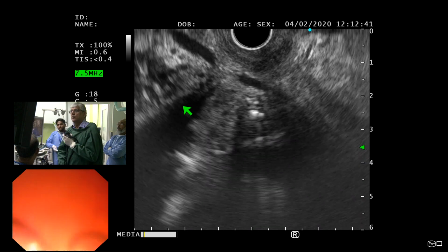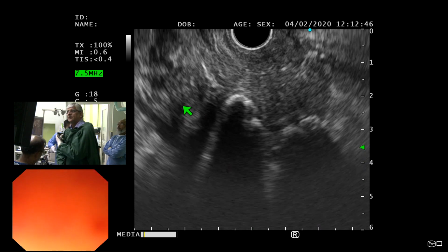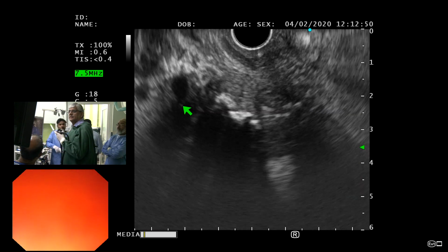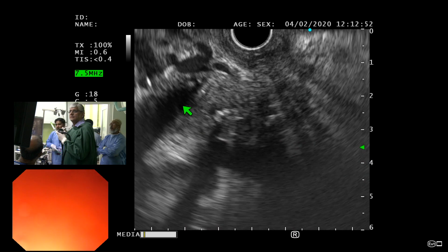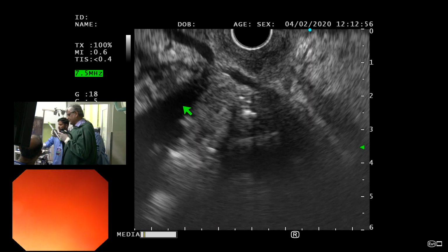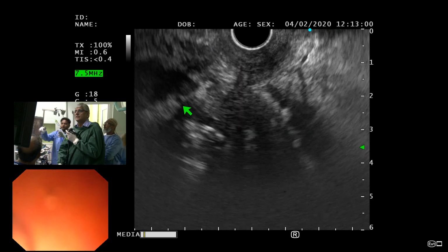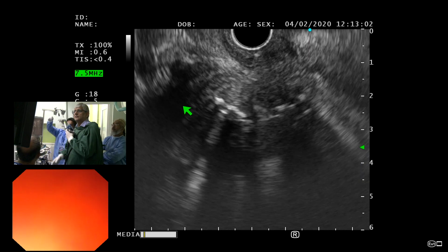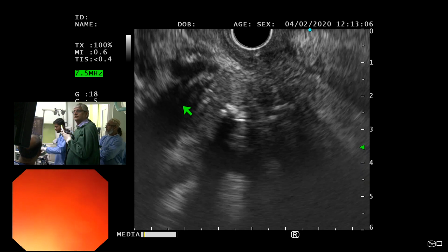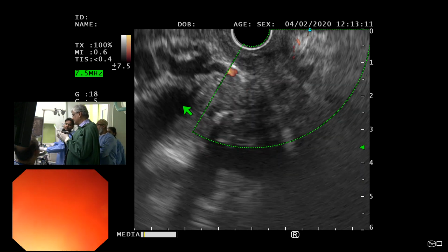I just want to go where the stent is. Okay. Doppler, please. Take this off. Doppler once again.